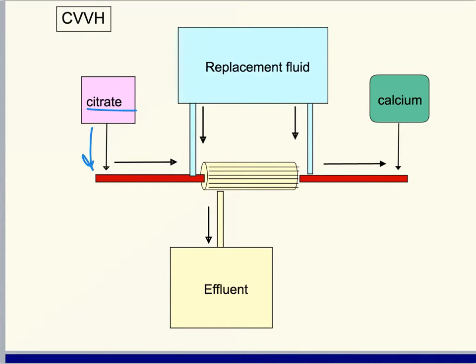It complexes with calcium, interfering with the normal process of coagulation as the blood travels through the capillaries. In order to avoid anticoagulation in the patient's circulatory system, calcium is infused just before the hemofiltered blood returns to the patient, so that serum ionized calcium is normalized. In other words, only the hemofilter is anticoagulated, the patient's coagulation cascade remains intact.